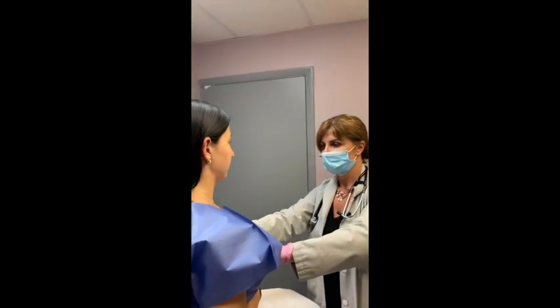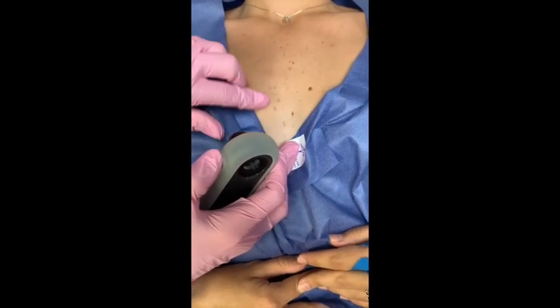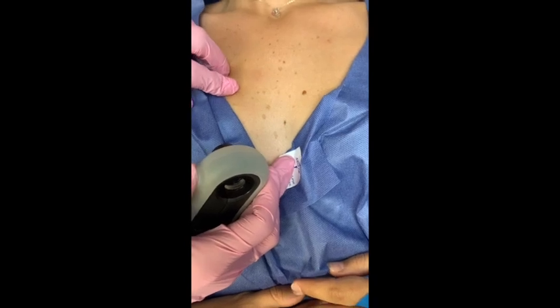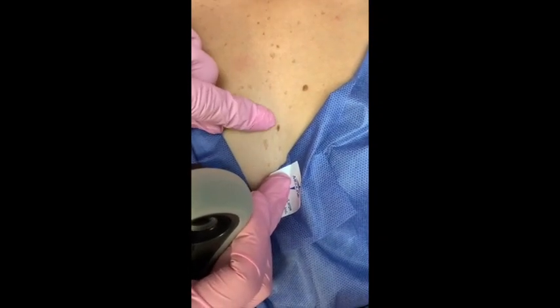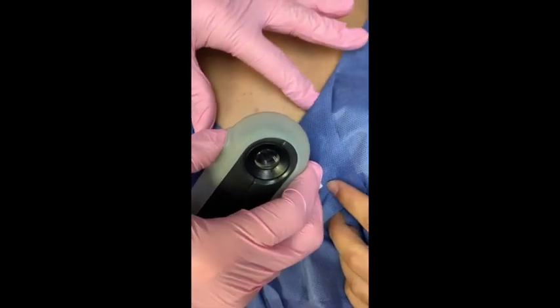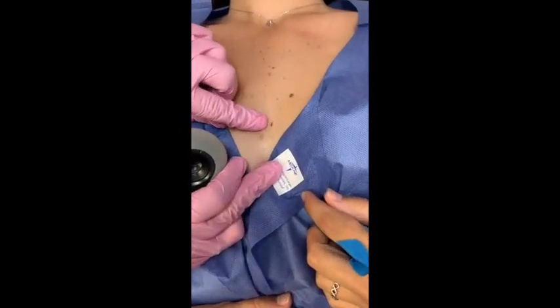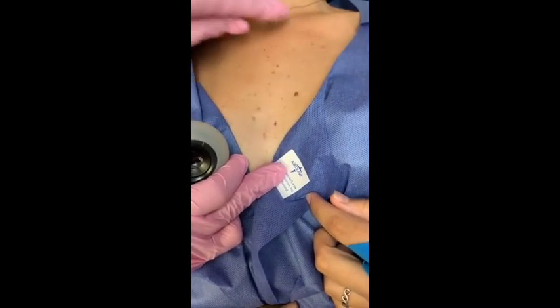Now we check the chest. There are several pigmented lesions here. The light brown ones are benign — same very light brown color, don't need attention. Two lesions need a little more evaluation: one is slightly darker and a different shape, another because it grew a little. Using my dermatoscope, I can see there is still symmetrical pigment distribution, so I don't think it's cancerous, but this needs to be watched — it's the one I'd watch most in this area.